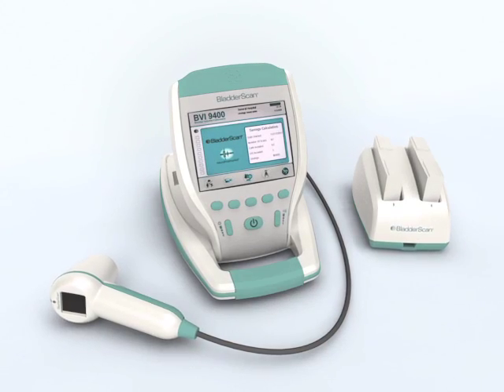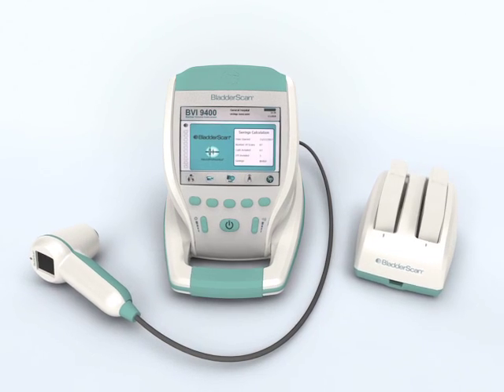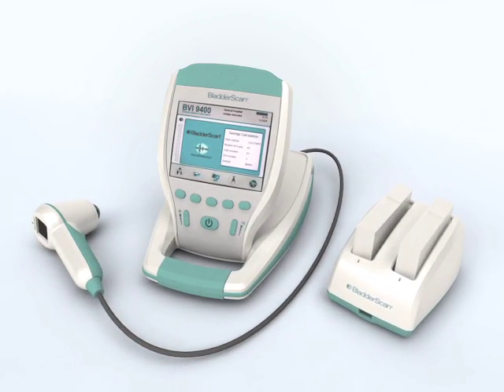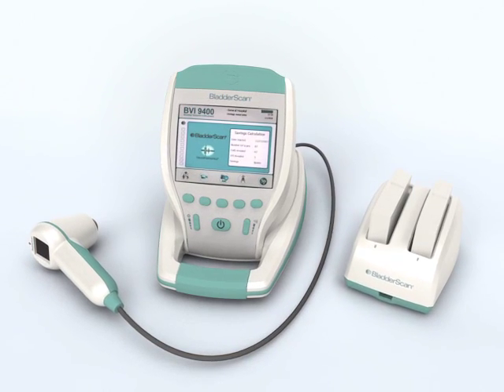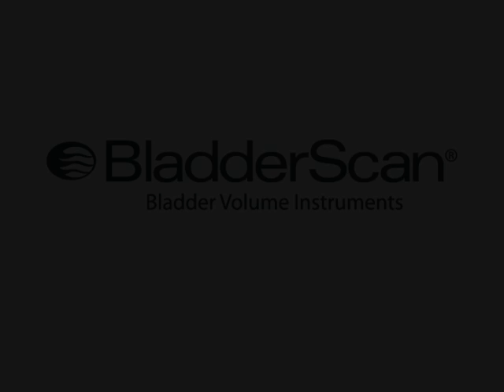It's that simple. The BladderScan BVI9400 gives you the information you need — quickly, accurately, non-invasively. The BladderScan BVI9400 with Neural Harmonics Technology: another dimension in bladder volume measurement.